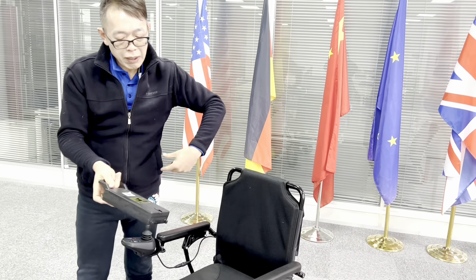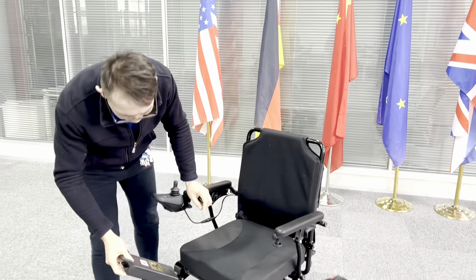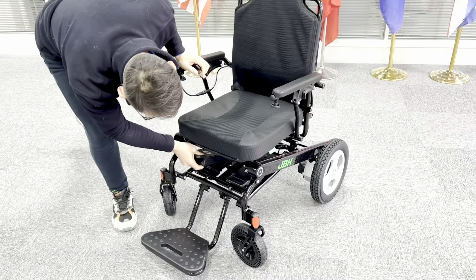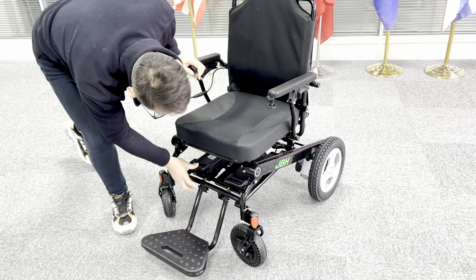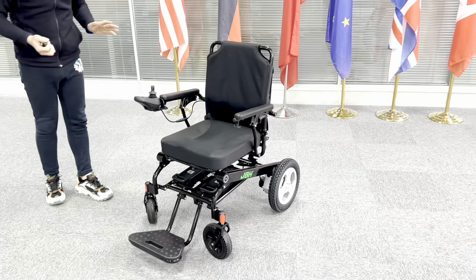It's a lot easier to put it inside a bag when you want to go on an airplane or you want to go somewhere and take it home or charge it. It's really easy. To put it back, just slide it in and click it. That's all set.